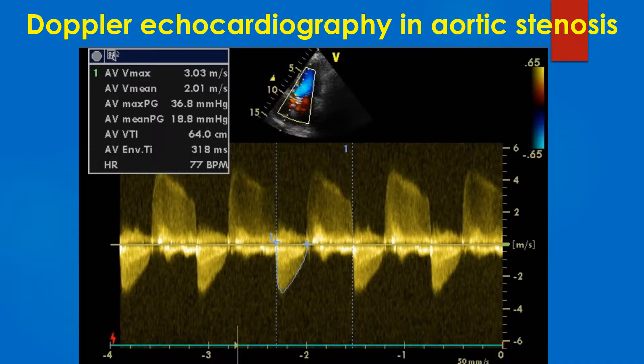The measurements shown here are: AVVmax – Peak Aortic Velocity; AV Vmean – Mean Aortic Velocity; AVmax PG – Peak Aortic Gradient; AV mean PG – Mean Aortic Gradient; AVVti – Aortic Velocity Time Integral; AV Env.Ti – Aortic Velocity Envelope Time; and HR – Heart Rate.